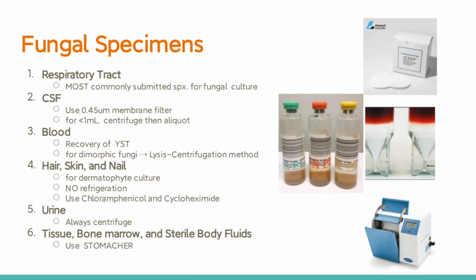Okay, now for fungal specimens, we have 6. So first one, the respiratory tract is considered the most commonly submitted specimen for fungal culture. Why is that? Because you always remember that the route of infection of spores and conidia would always be inhalation.